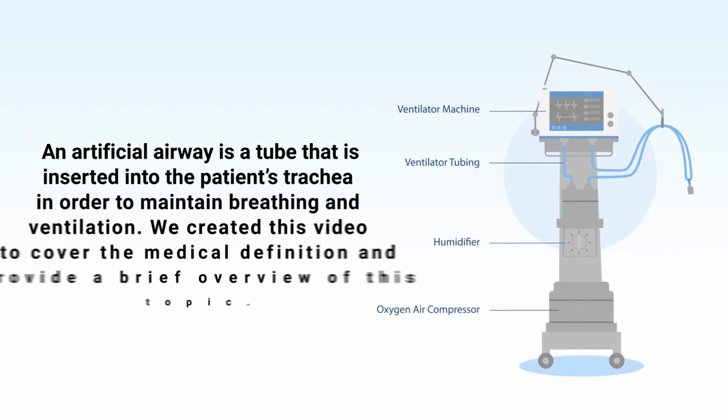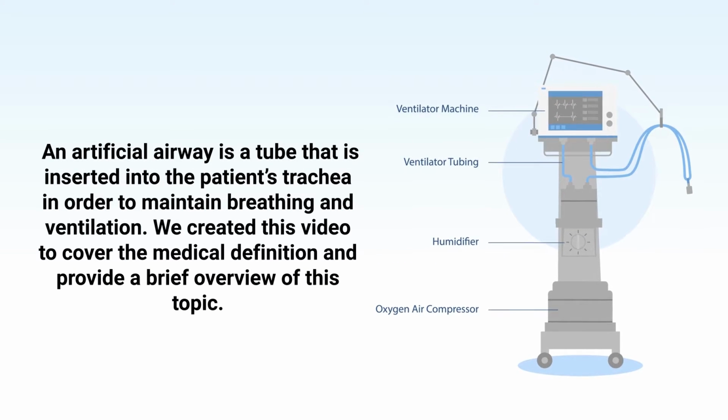An artificial airway is a tube that is inserted into the patient's trachea in order to maintain breathing and ventilation. We created this video to cover the medical definition and provide a brief overview of this topic. So if you're ready, let's get into it.